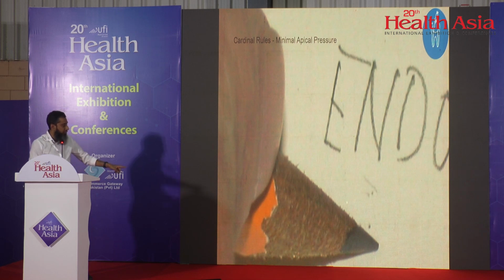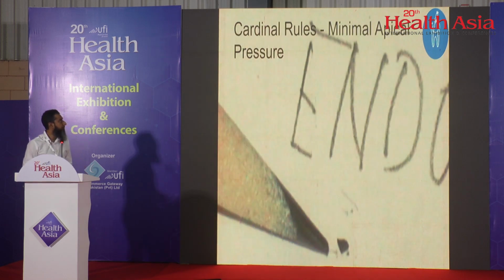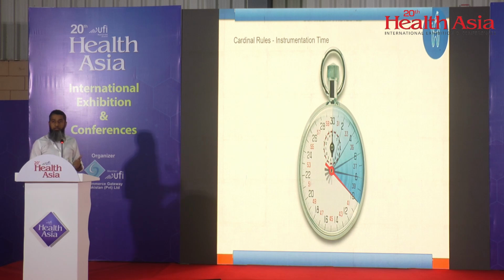Like here, it's shown that if you're using a sharp pencil, you write with it very gently. The moment you apply greater force, the nib of the pencil will break. So here also, you need to be careful while using rotary because it's already running in an electric motor, so you do not need to apply that much force. You just have to move it gently into the canal and it will do its work. So minimal pressure, otherwise, like here it's shown the sharp pencil nib can break, so similarly a rotary file can break.